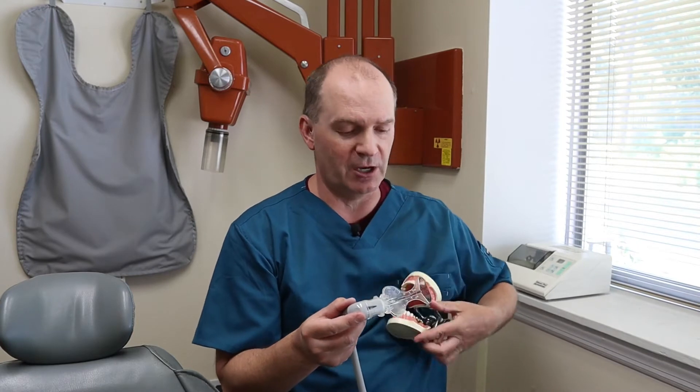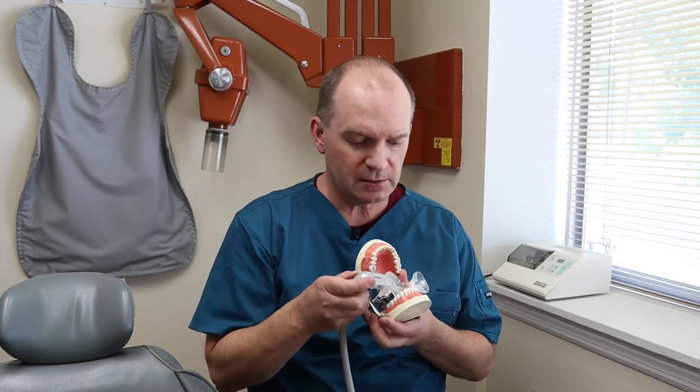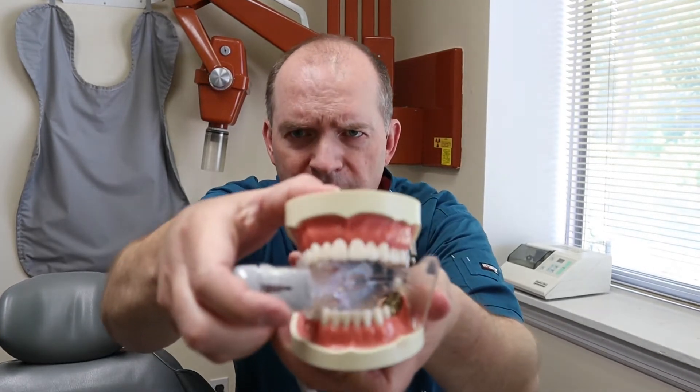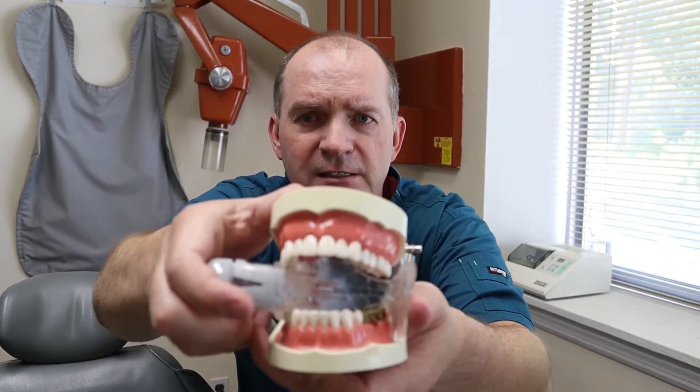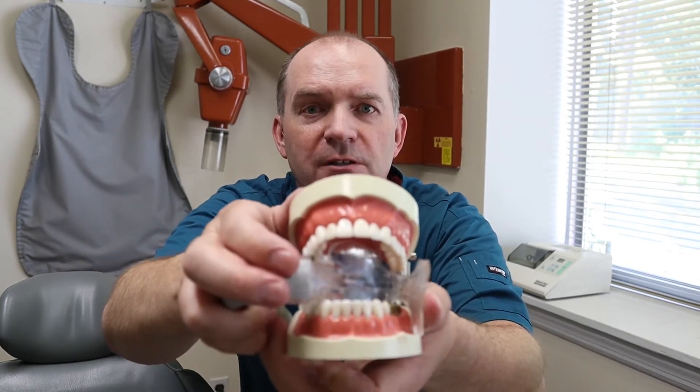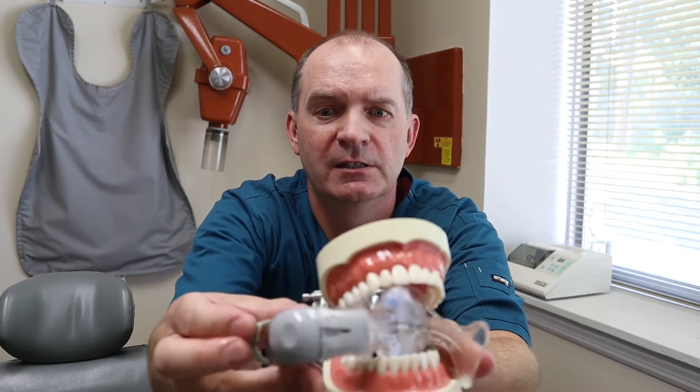Let me show you how it works on this tooth model I have. So you position it, the person bites down on the bite block, and — let me zoom in on it — it keeps the cheek out of the way, keeps the tongue out of the way. It's got built-in vacuum, both top and bottom, so it vacuums up the saliva and also helps vacuum up some of the water spray coming from the drill. It basically makes the procedure go faster. You're going to be more comfortable, I'm going to be more comfortable, I can get it done quicker, and I can do a much better job.